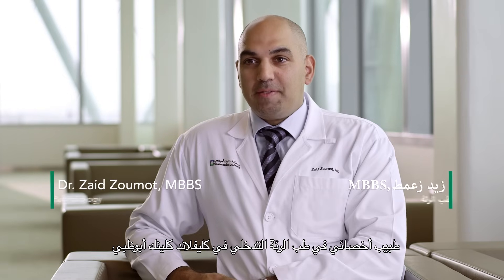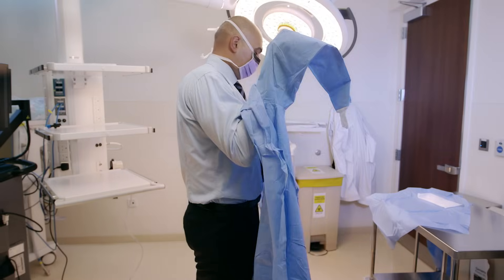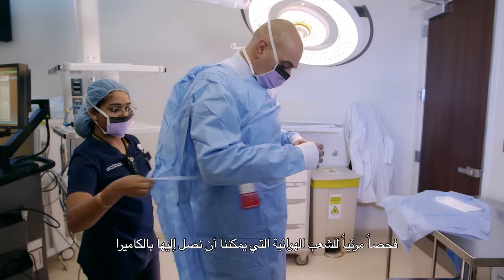My name is Zaid Zoumat. I'm a staff physician and interventional pulmonologist at Cleveland Clinic Abu Dhabi. A diagnostic bronchoscopy in the initial phase involves a visual inspection of all the airways that we can reach with the camera.